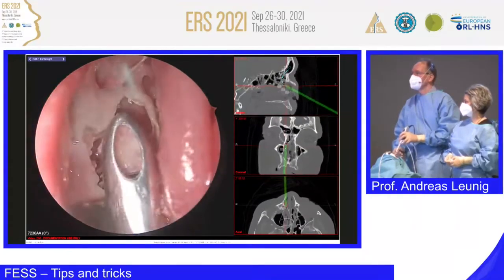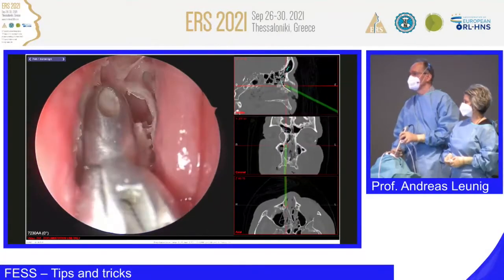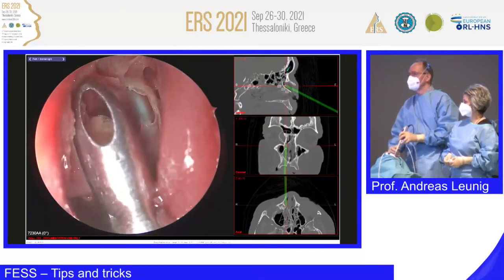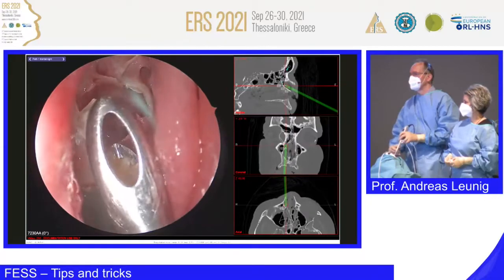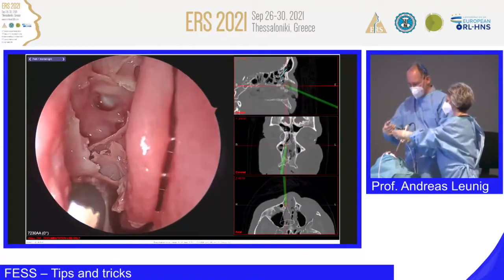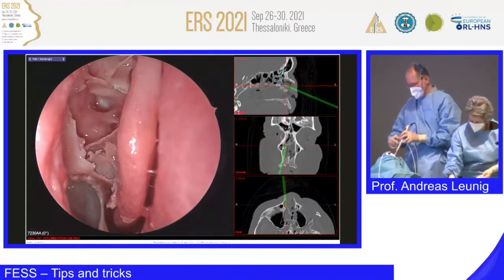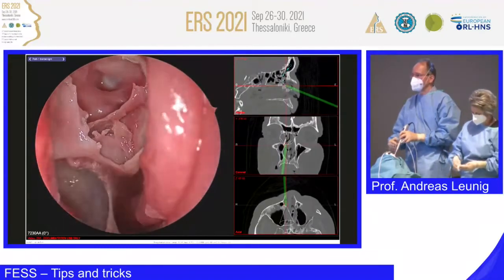Okay, I try to nibble away. I try avoiding tearing mucosa. You see, I'm sometimes very angry with myself when I'm using an instrument and I'm tearing, I'm denudating bone, but sometimes this happens. But in this case, you can really replace the mucosa and cover the bone again. So, just take your time.